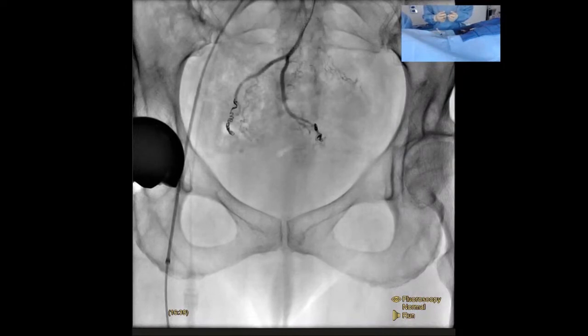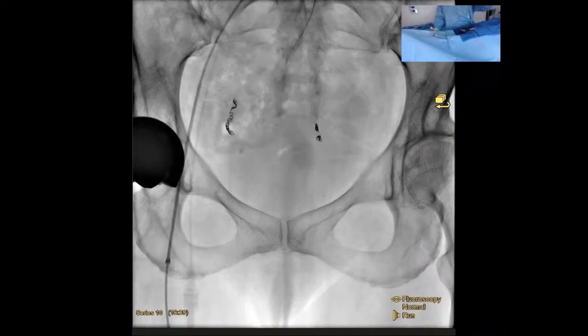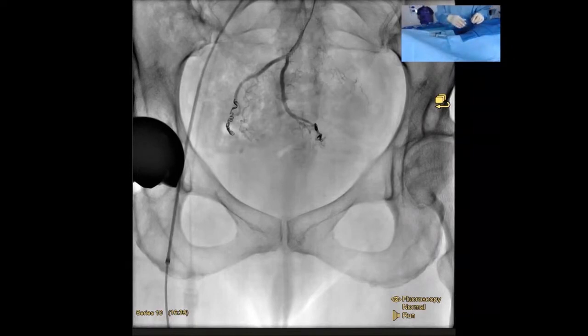That's our completion run here. You can see we have great, if you will, diminished vascularization here towards the rectum. But I tend to work in this projection. It's fairly obvious to see. Now, if I'm on one side and it's my last vessel, of course, then I'll go to an oblique projection and look for something else. But you can see here, this is what we'll typically do. In a case like this, without a large middle rectal inflow, we won't typically examine or look at the internals.